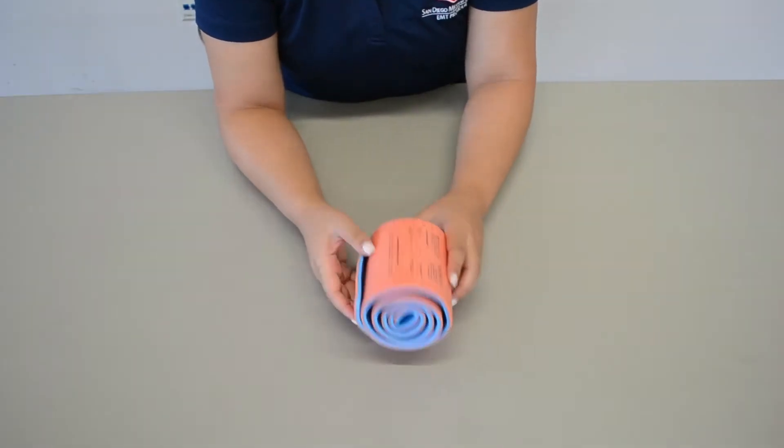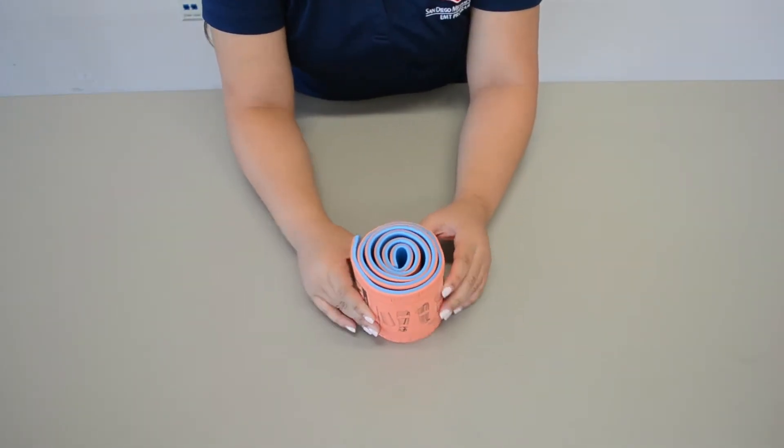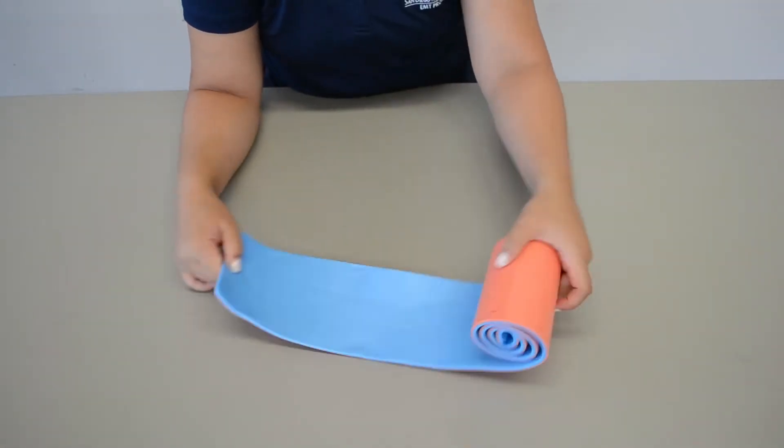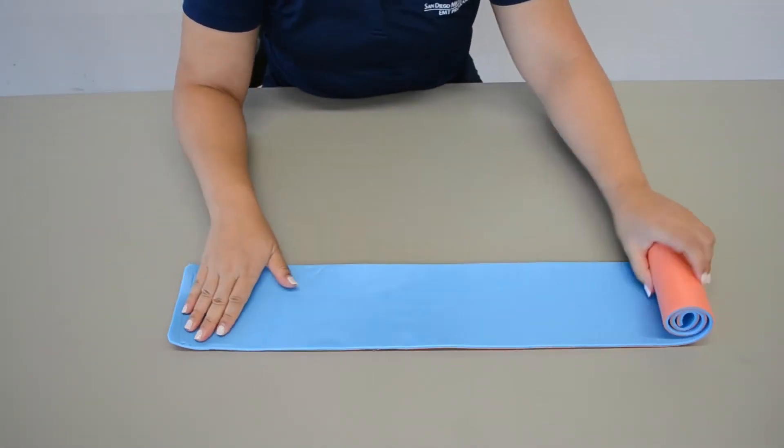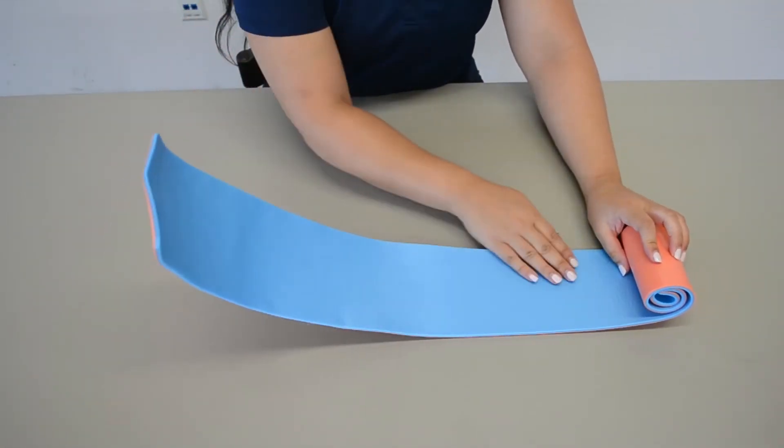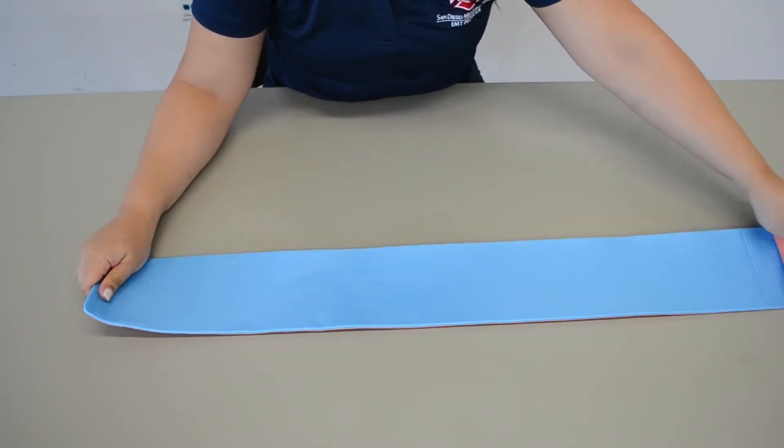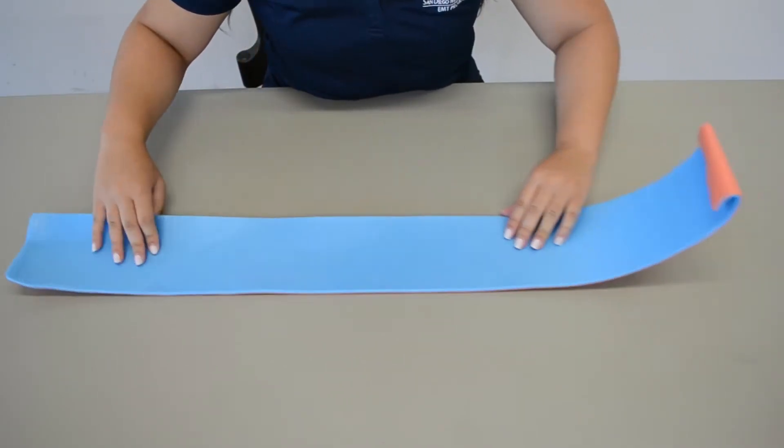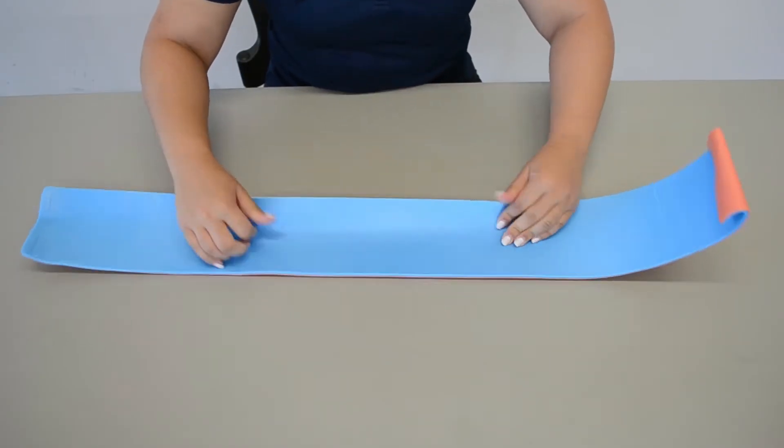Alright, so this is going to be your SamSplint. It's going to come wrapped like this, so you're just going to go ahead and unravel it. The SamSplint has aluminum inside in between these foams, and it's very malleable. You can shape it to any form you'd like.